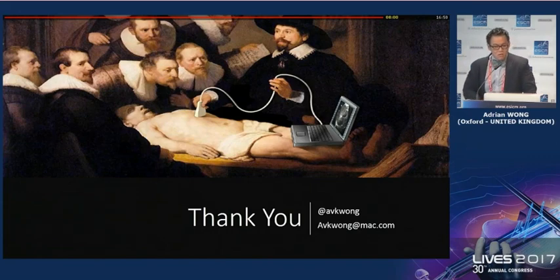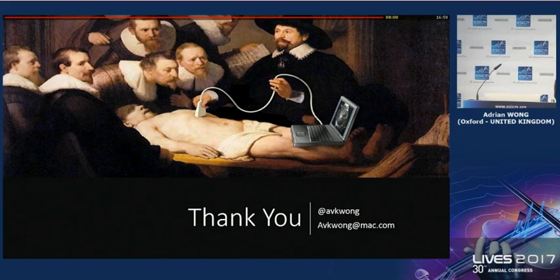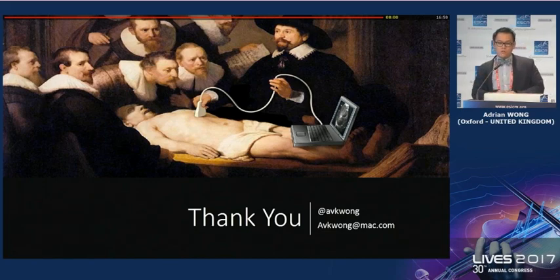Time for a short question, yeah? You said the diagnosis of pulmonary embolus is just an indirect diagnosis, because with the right side enlargement, this is the only way you can tell. Okay, so the question was using echo ultrasound to talk about pulmonary embolus and right-sided features. I'm sure all of you are aware of differentiating pulmonary embolus into massive, submassive, and so forth. The crux is hemodynamic instability, isn't it? And hemodynamic damage. How are you going to do that? Yes, you've got BNP, troponin, ECG changes, but actually by the bedside, in real time, echocardiography is it.